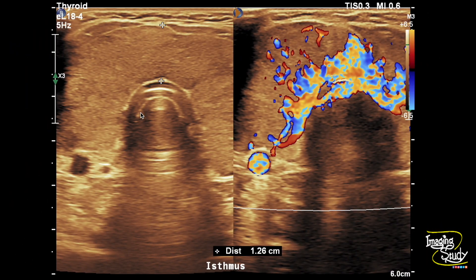There's the measurement of the isthmus, which is also thickened. If you look at the right picture, you can see we have put color Doppler. This is a regular thyroid setting of the machine — if you put the color Doppler you'd normally see some tiny vessels here and there. But with this setting we can see aliasing, which indicates a very high velocity flow throughout the thyroid gland.